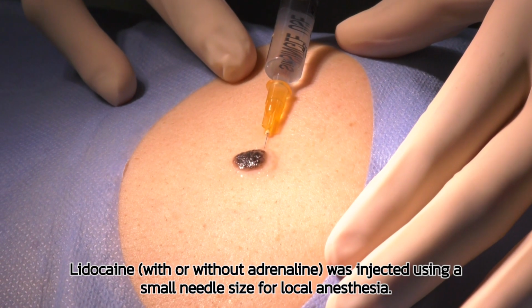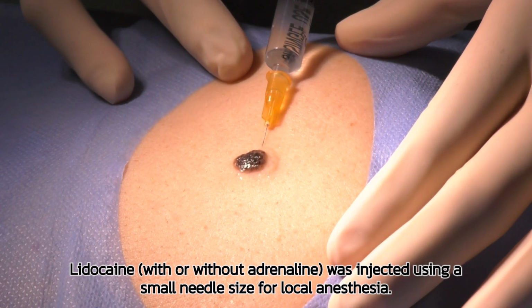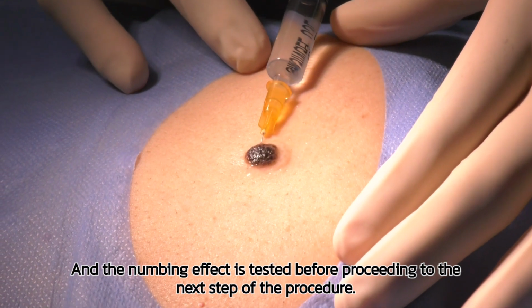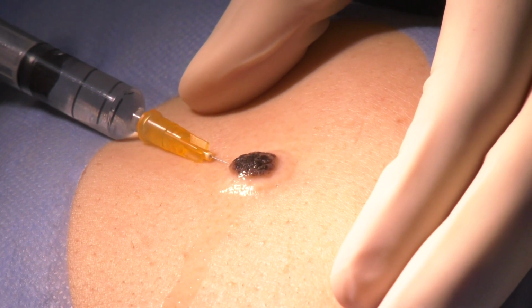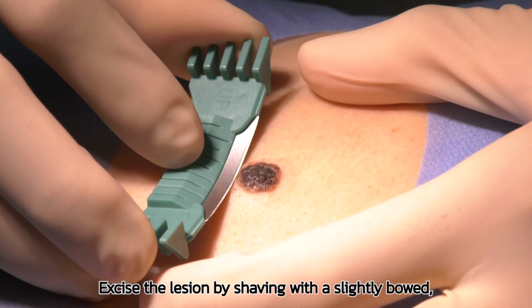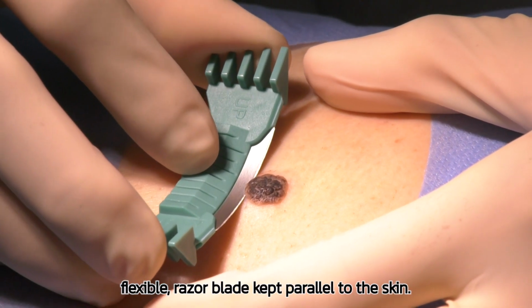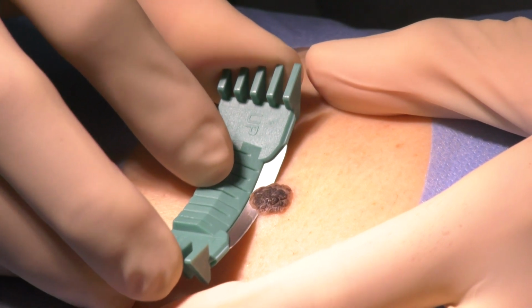Lidocaine, with or without adrenaline, is injected using a small needle size for local anesthesia, and the numbing effect is tested before proceeding to the next step of the procedure. Excise the lesion by shaving with a slightly bowed, flexible razor blade kept parallel to the skin.